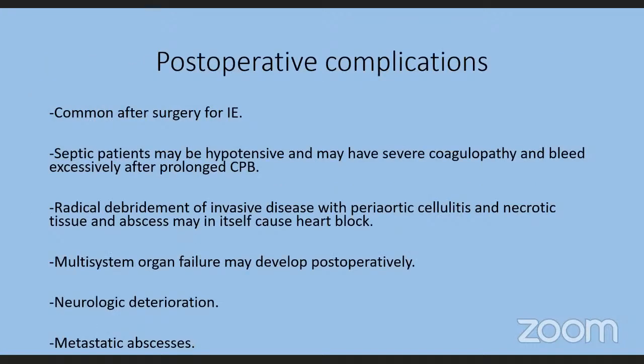Postoperative complications are common after surgery for infective endocarditis. Septic patients may be hypotensive and may have severe coagulopathy and bleed excessively after prolonged bypass. So after extensive debridement and allograft root reconstruction, surgical bleeders must be controlled before protamine administration. And after administering the protamine, the field must be packed and suction avoided for 20 to 30 minutes for clotting to occur.